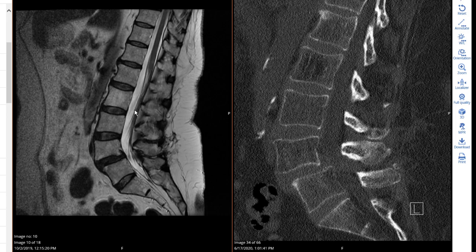I want to mention that this is the fourth fusion case of the day. Previously, we did a four-level and two three-level fusions in the same day, so this is nothing unusual — we do sometimes up to six fusions a day, which with the good team we have in Crookston, is possible.